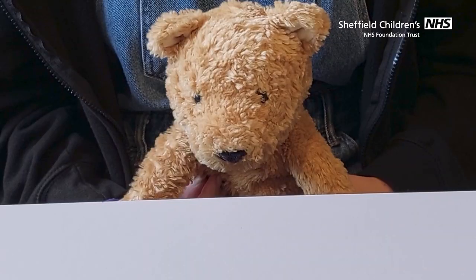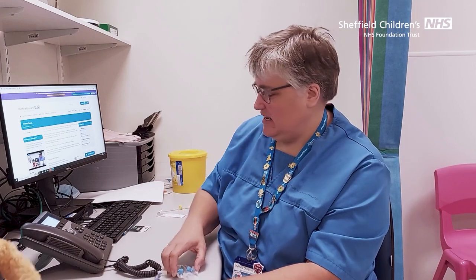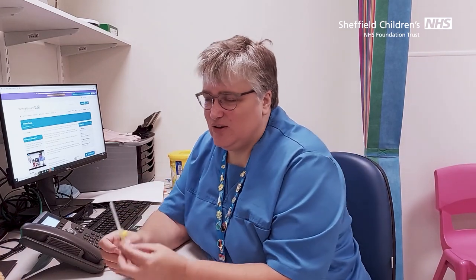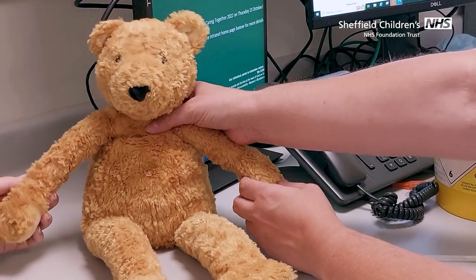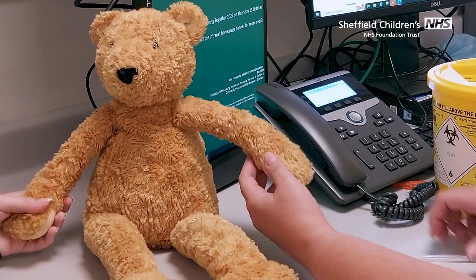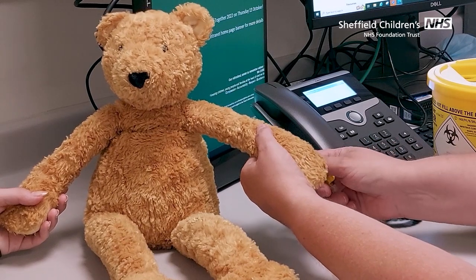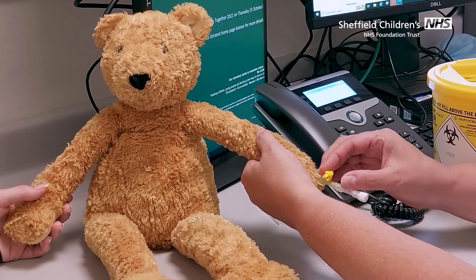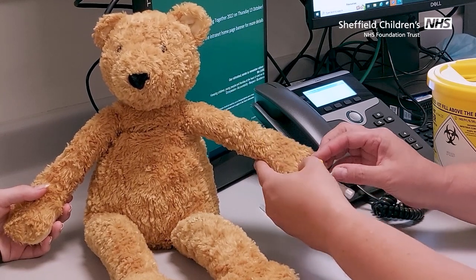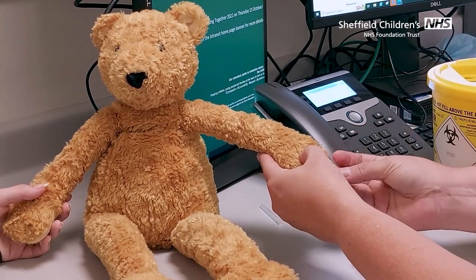Well, what I thought we'd do is perhaps try putting a cannula in your teddy — and I see you've brought your teddy here. Who's this? Aussie. Would Aussie like to sit on the desk? And what we've got here is an Aussie-sized cannula. So Aussie should look the other way, and he'll need you to hold his paw, and I'm going to put his cannula in this side. Give his arm a little squeeze. I'll have the cannula here — we'll tap his paw, put the cannula into his paw, and then take away the needle which will go straight in the bin, and put the little bung back on the end.